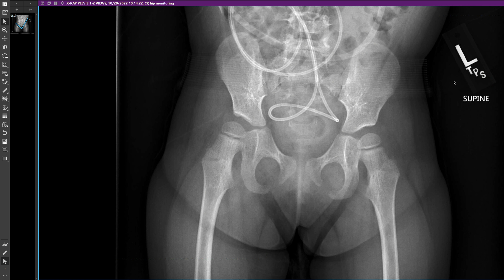Hi everyone, Mahesh here. Today we're going to talk about how to do migration percentage measurements on a pelvic radiograph. We're frequently asked to do this in kids who have cerebral palsy or other neuromuscular causes of hip deformity. This is a great way to give objective numbers and measurements as opposed to relying on statements such as mild, moderate, or severe uncovering of the femoral heads.